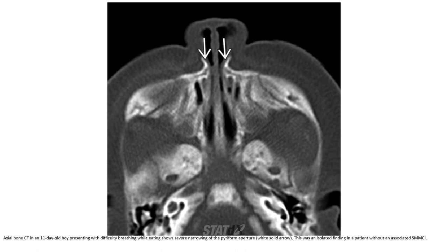Axial bone CT in an 11-day-old boy presenting with difficulty breathing while eating shows severe narrowing of the pyriform aperture. This was an isolated finding in the patient without an associated solitary median maxillary central incisor.